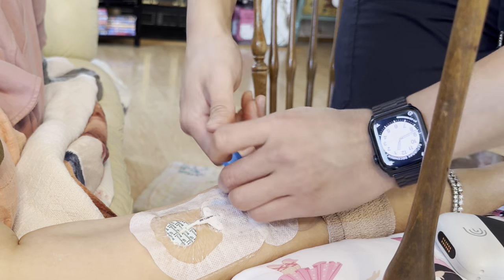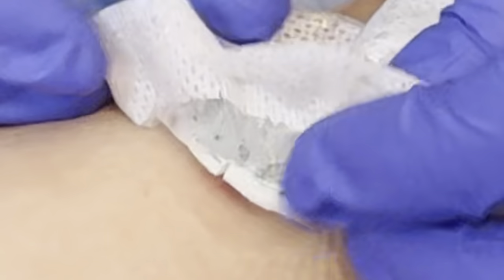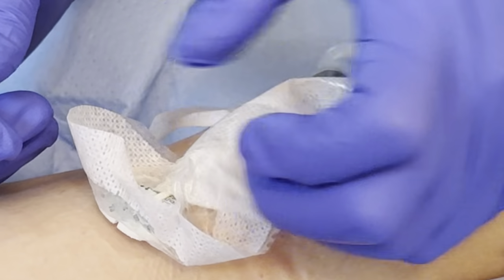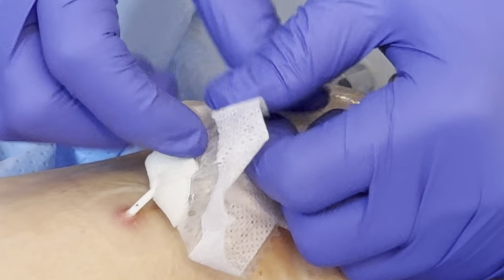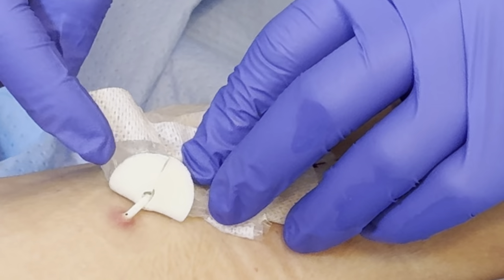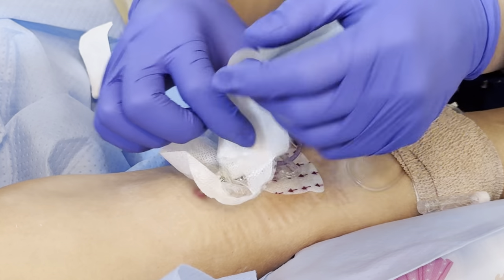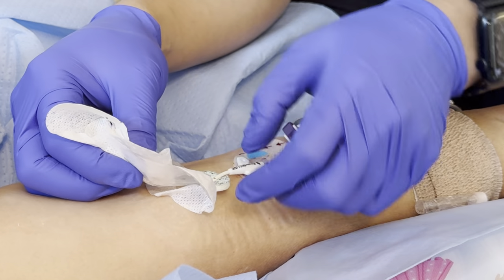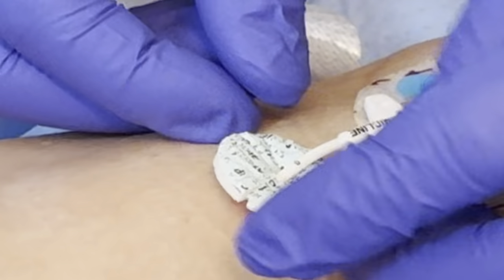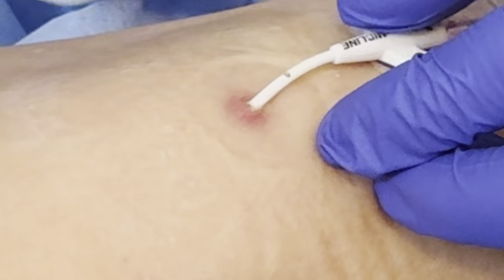I really like these scrub hubs because they go into the crevices. Because the slit is open this way, I have to be more careful. If you come across this, the problem with this catheter is that when you're not careful during the dressing change, you're going to piston that catheter out. Why? Because the orientation of the slit has hooked the catheter, and when you manipulate it to pull it off, it'll pull the catheter out. My recommendation is to slowly go away from the tail to gently get it off, and then be even more careful because of the way it was placed.